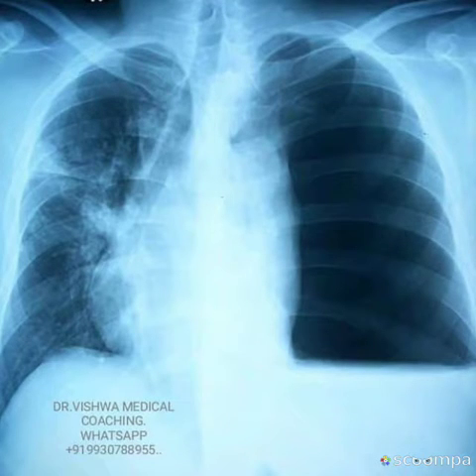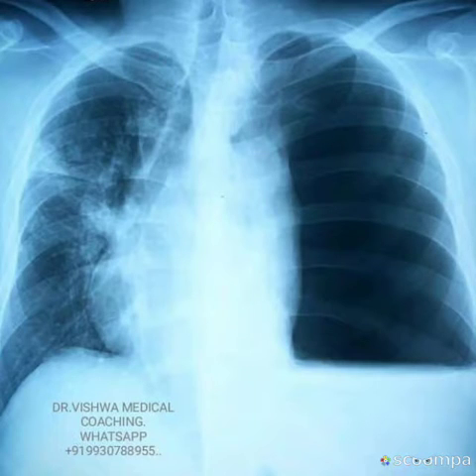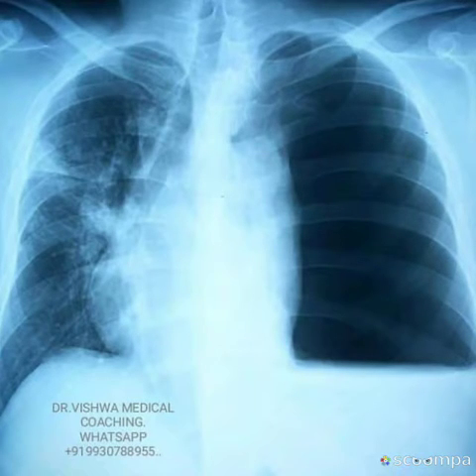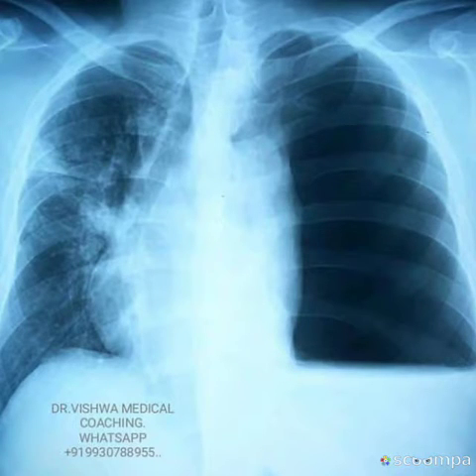This huge pneumothorax is shifting the heart to the right-hand side. Also understand that the angles are not clear — the costophrenic angles are not clear — which means there has to be fluid also in the costophrenic angle. So remember, this is an important X-ray.